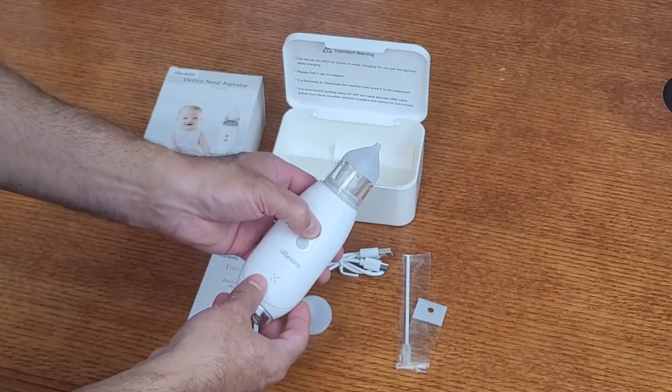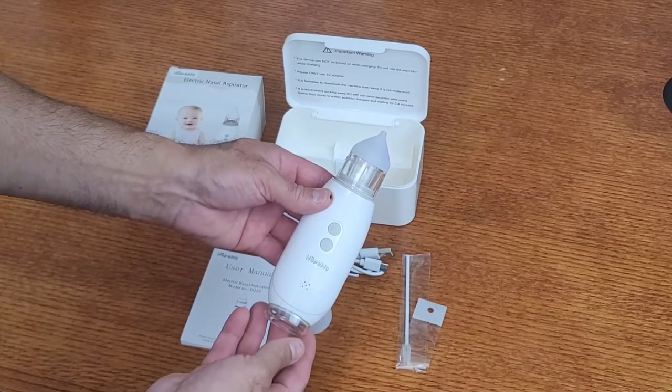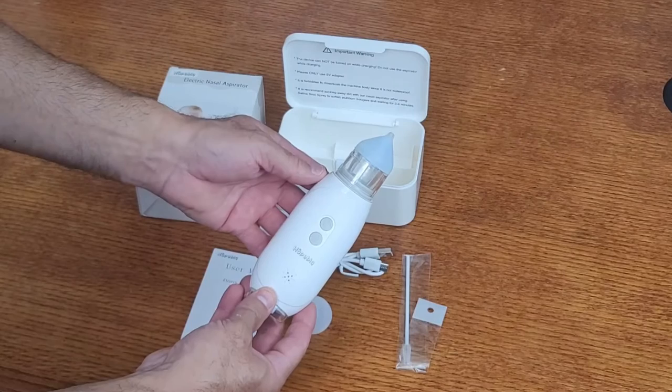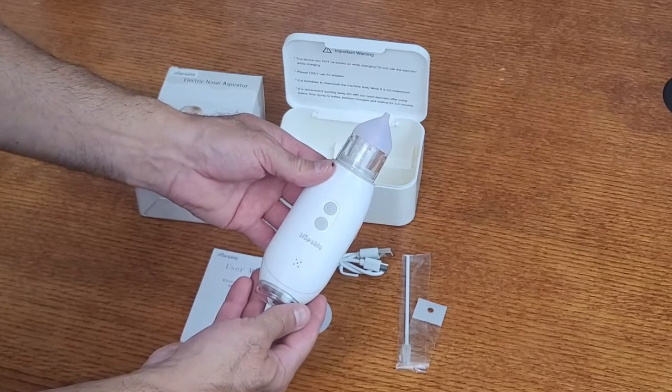Press and hold this power button for about three seconds. You'll see the light illuminate here and you'll hear the fan run on its lowest setting. If you'd like to increase the suction, just short press the power button one more time for medium, and then short press again for high.